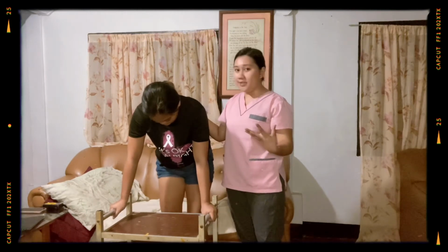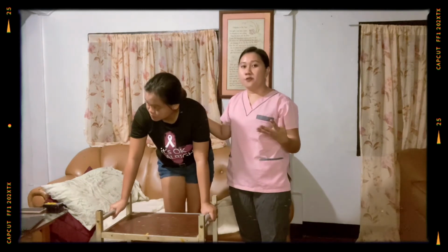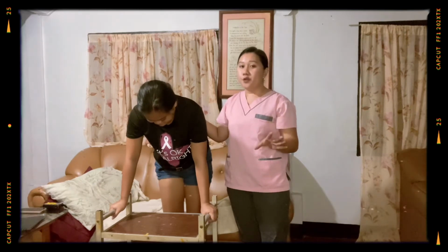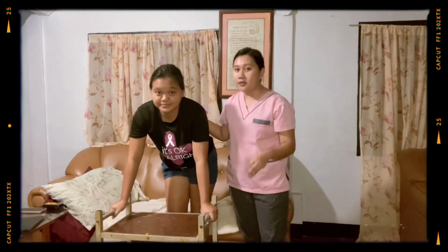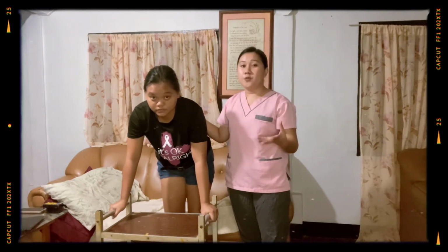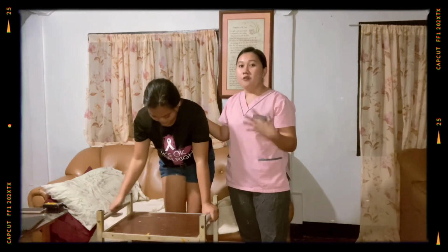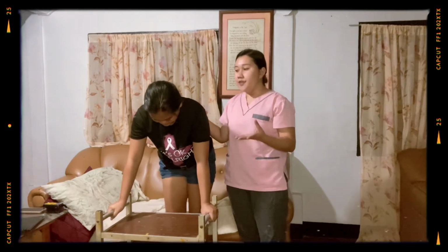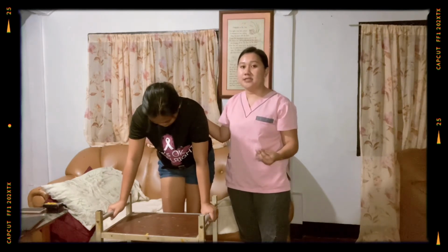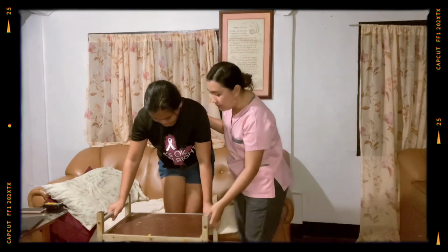So let us proceed to the next procedure, which is procedure number 10. Have the patient move the walker forward 6 to 8 inches and set it down. Make sure all 4 feet of the walker stay on the floor. Then tell the patient to step forward with either foot into the walker. So supporting him or herself on his or her arms, follow through with the other leg. This is to maintain maximum support that is required for patient safety and balance. So, ma'am, I would like you to move while holding the walker.